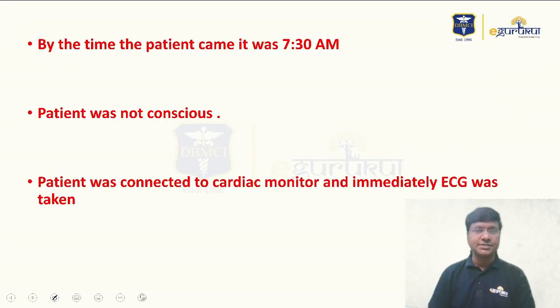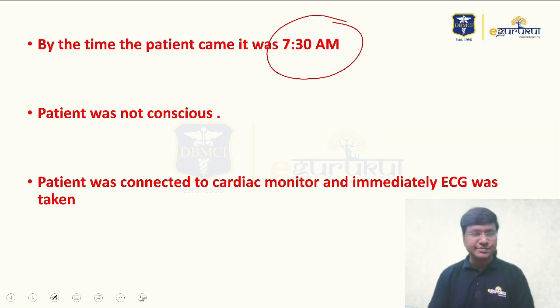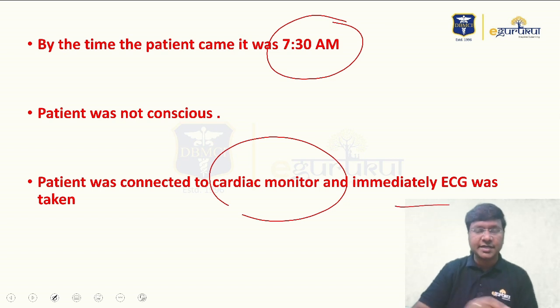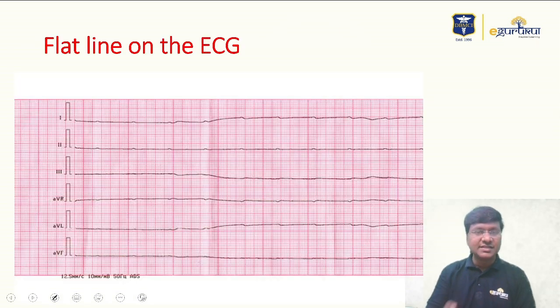And the same patient, by the time he came, it was almost 7:30 a.m. The patient was not conscious and was connected to the cardiac monitor, and immediately an ECG was taken. And you know what the ECG was? You will be surprised. This was the ECG of the patient when we took it. So it was a flat line.